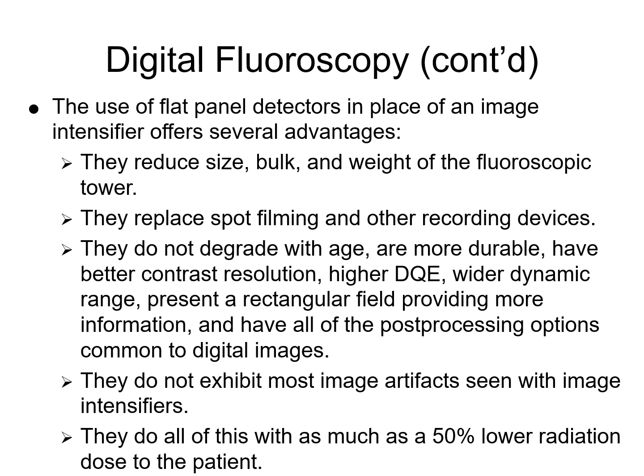Like if you're playing a motion picture loop, a cinematic loop, you make the changes that you want to brightness and contrast, or maybe you zoom in to a certain area of it, and then it'll apply your changes to all of the frames in that loop and then play the loop in real time. And then again, north of 30 frames a second, it fools you into motion picture.